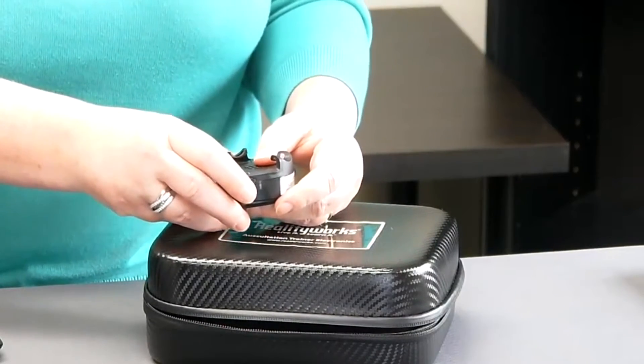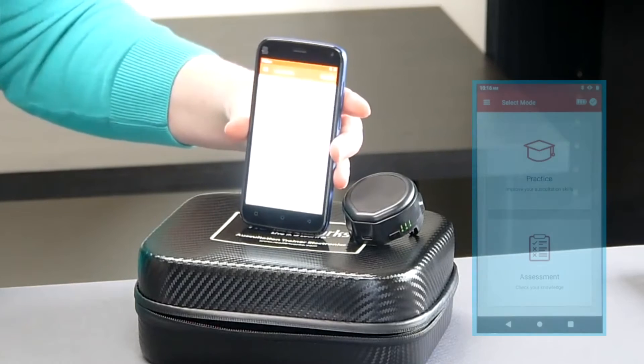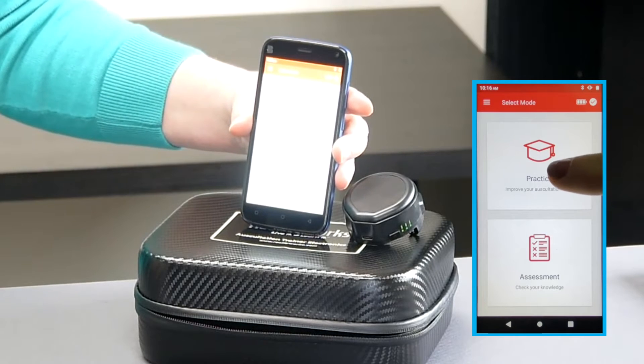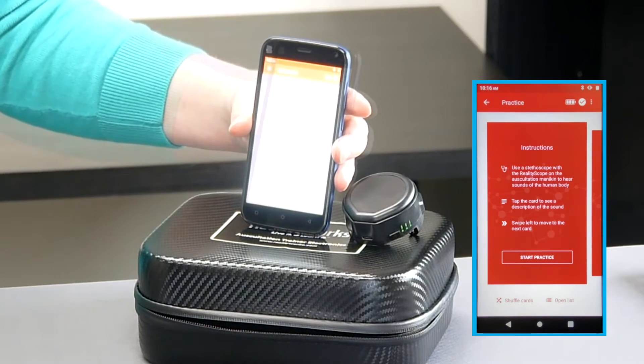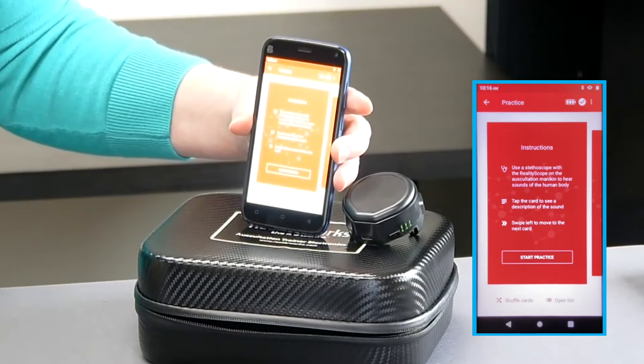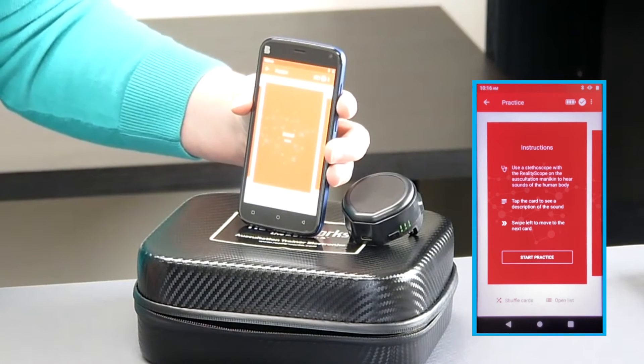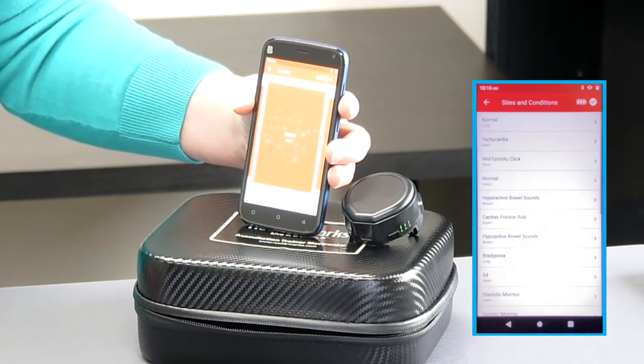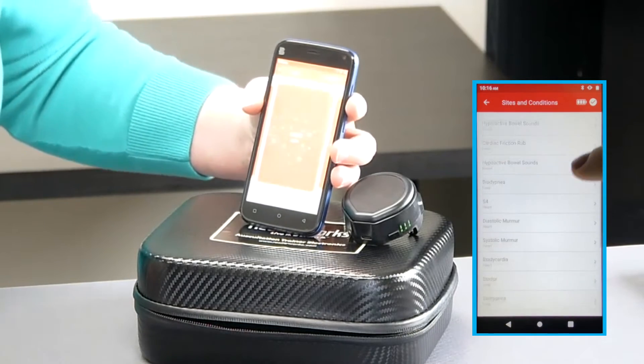Let's take a closer look at that tablet. There is a practice mode and an assessment mode. There are a couple of different ways to use the practice mode. The first is just with the tablet — students are presented with some instructions and then a series of cards on the screen that are available to listen to. Tap 'Open List' to see the list of sites and conditions.